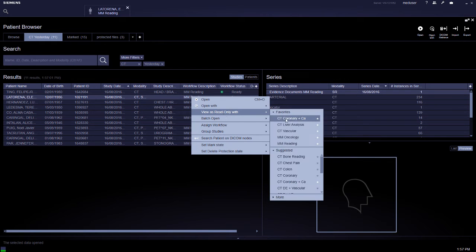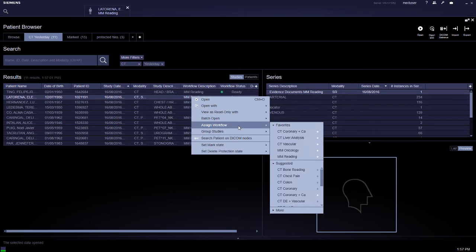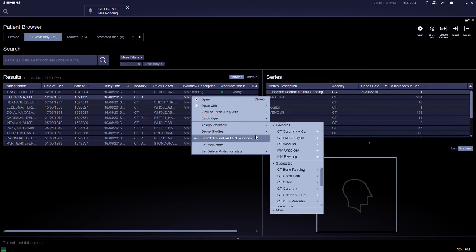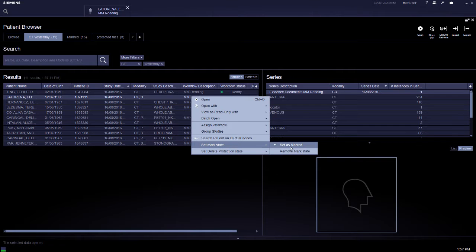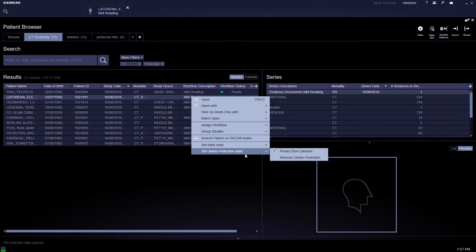Read-only is to open without any saving of results. Assigning is to just assign a workflow without opening. You can also set it as a mark, and set the series or patient data to protect from deletion from the syngo.via server.